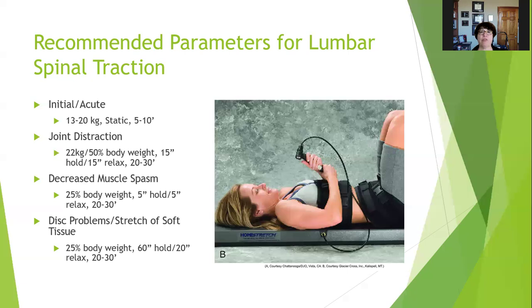Okay. If you're using a home unit like is shown here, this is a lumbar home unit, you can do intermittent just by timing it, and the patient is controlling the pressure. So if the patient is getting a home unit and you're teaching them how to use it, you can show them how they can control the pressure, and I let them hold it. In the mechanical systems, there's a stop switch that you give the patient so they always have control. One person I used to work with, she called it the chicken switch, which I thought was kind of funny. But they can always stop it and the pressure will go off.